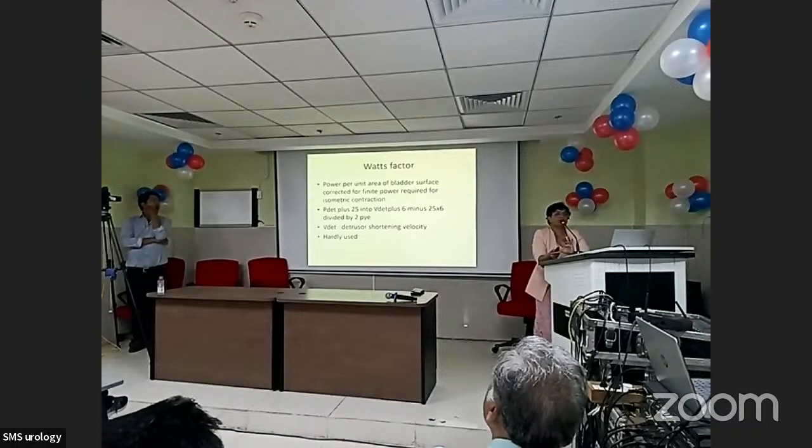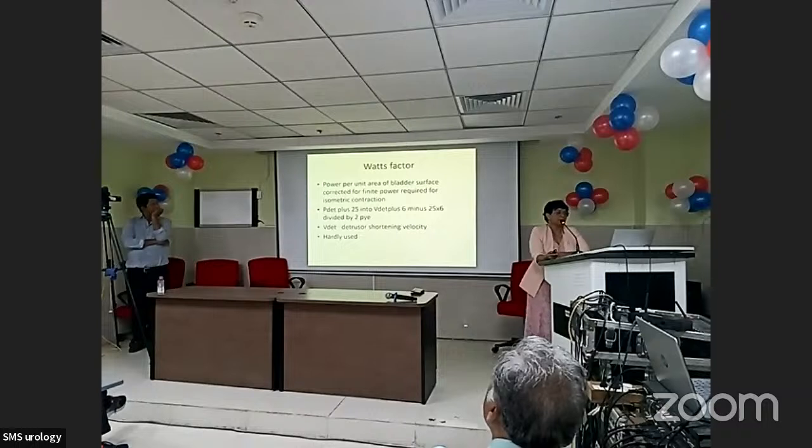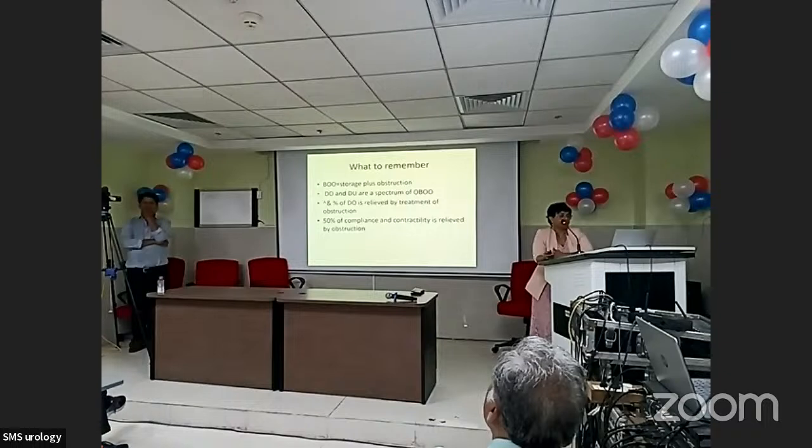Now, this is also one more theoretical calculation where we try and find out whether the detrusor is acting properly or it is the detrusor that is at fault. And this equation is given in Campbell. I won't waste my time on it. We do not use it in regular practice.